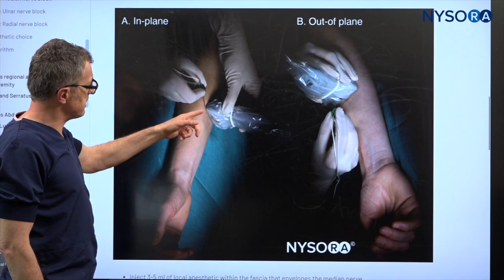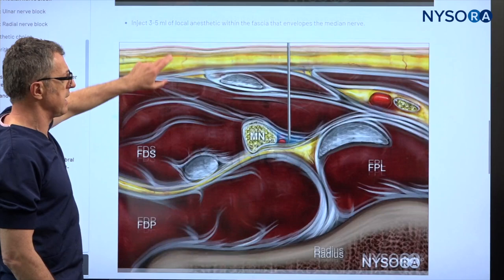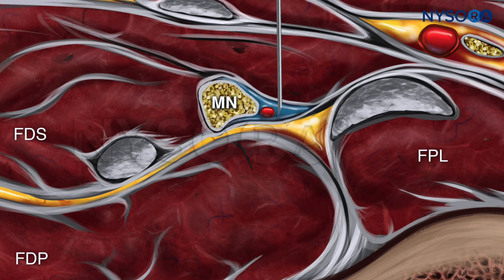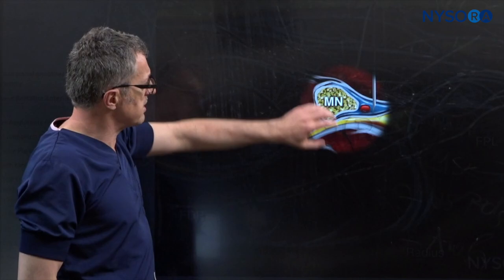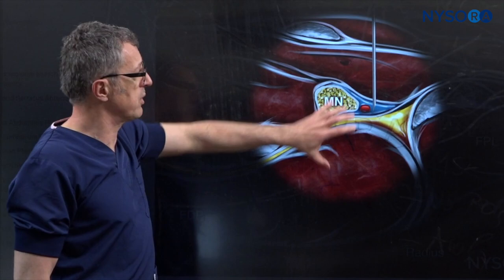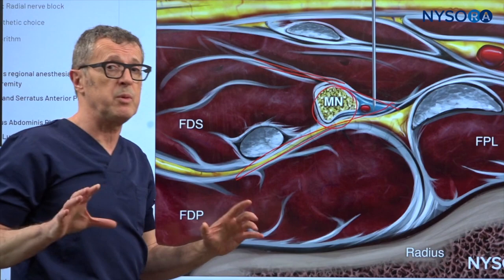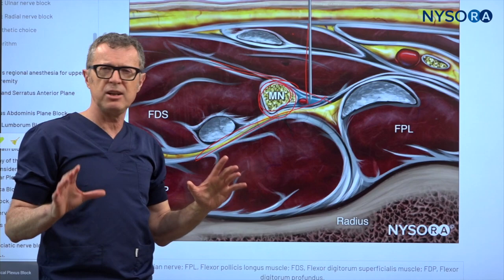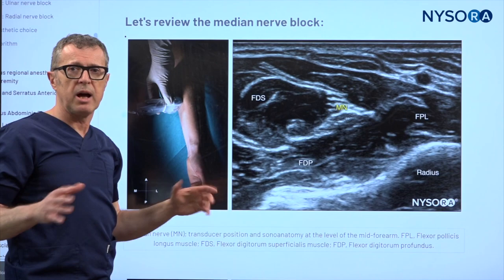Let's do the block. Here we can see the probe position as demonstrated — that's the needle insertion in-plane, and that's another example where you can also do needle insertion out-of-plane, because this is a very superficial block. Median nerve block can be accomplished either way. The bottom line is that you want the needle positioned in between those tissue planes. Novices always tend to focus on the nerve itself, but experts focus on the structures around it — the tissue planes — because we're injecting into the plane that contains the nerve, not around the nerve.